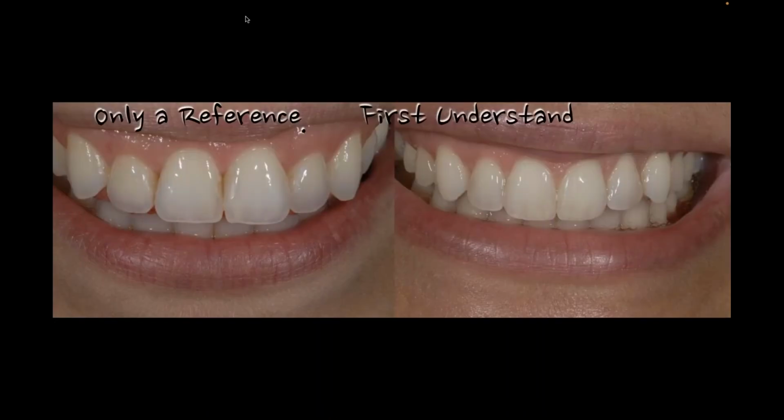So when I say you need to understand what you're looking at, let's break down those three keys again. For one, we start with the cervical. And what you should always notice on the cervical of your tooth is where you see the most chroma, the most influence of pink from healthy gingival tissue, and usually a certain amount of translucency there. So that's the first part that I want to communicate.